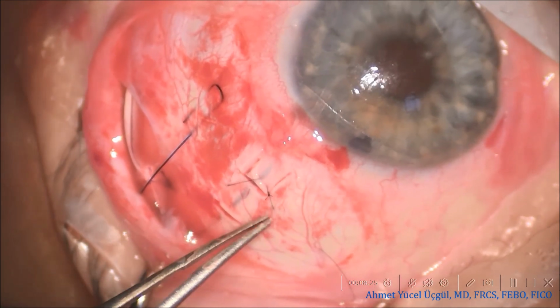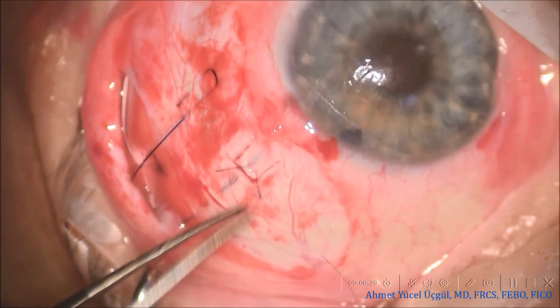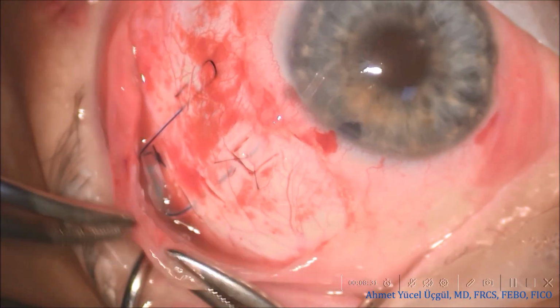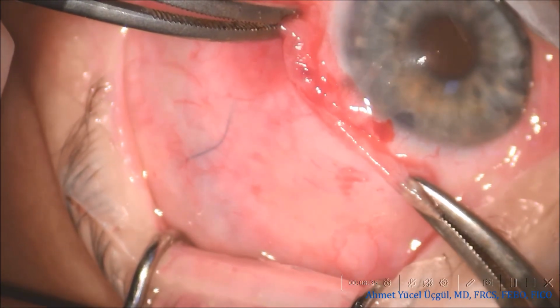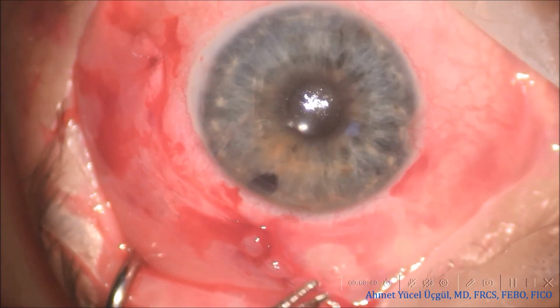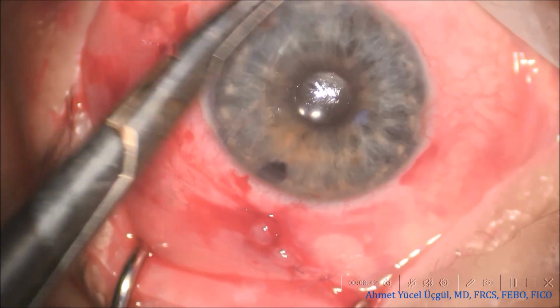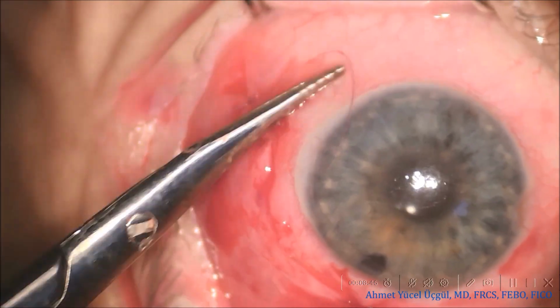At the end of the case, once the 10-0 nylon sutures are carefully buried, the conjunctiva and Tenon's capsule are then closed. Then, intracameral antibiotic is administered, and the paracentesis is sealed by stromal hydration. The viscoelastic that was placed earlier in the anterior chamber does not need to be completely removed. To be clear, the anterior chamber should not be overfilled with OVD.